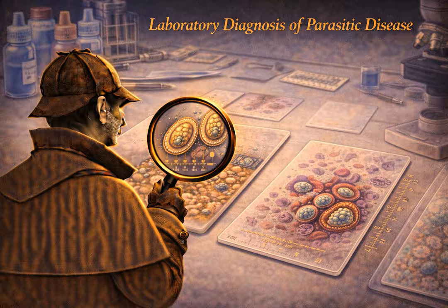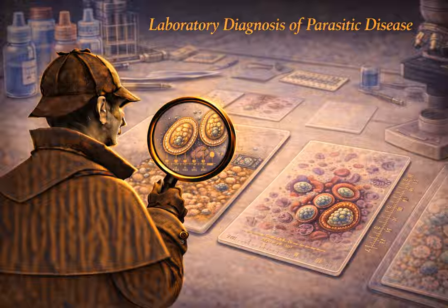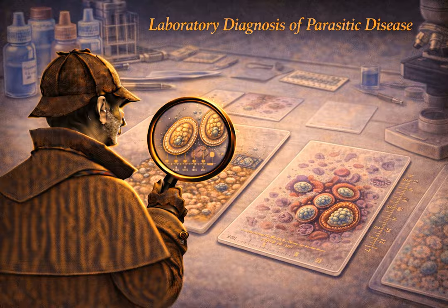They might temporarily stun the organism or just reduce the total numbers below our visual detection threshold without actually curing the infection. So it's a false negative. Right. And second, for protozoa like Entamoeba, they literally feed on the ambient gut bacteria. If you wipe out the normal bacterial flora with a broad-spectrum antibiotic, the protozoa starve. So they immediately encyst, forming their hard protective shells, making them much harder to find and identify. You've completely altered their ecosystem.